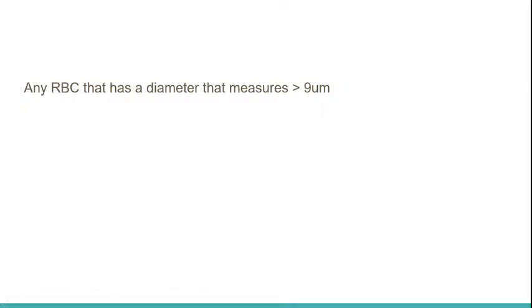So in the perspective of slides, if we're not looking at the automated analyzer reports. But usually in actual practice, you'll see this. Okay, MCV is above 100. All right. Let me check in the slide. Yeah, they're a bit larger than normal. So more often than not, practitioners would ignore the actual measurements in the microscope, because not a lot of microscopes today have graduations or measurement rulers inside, provided in the slide or in the objectives.